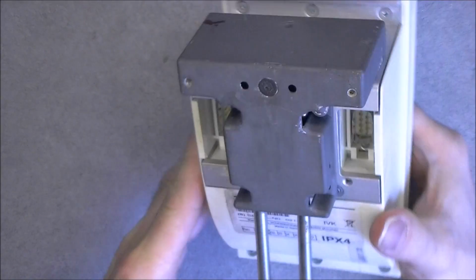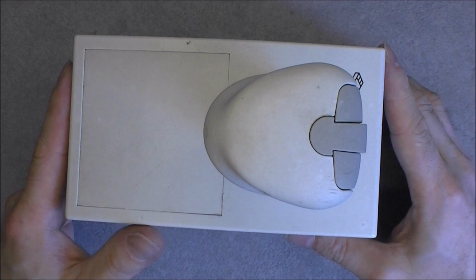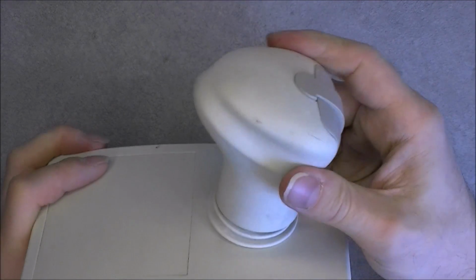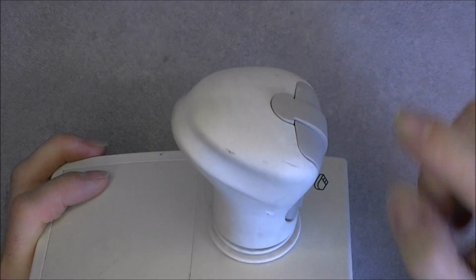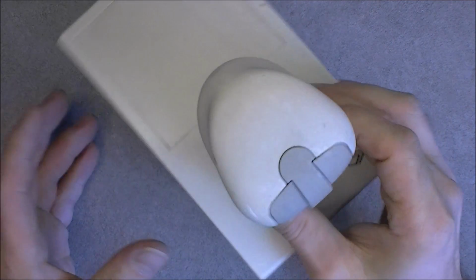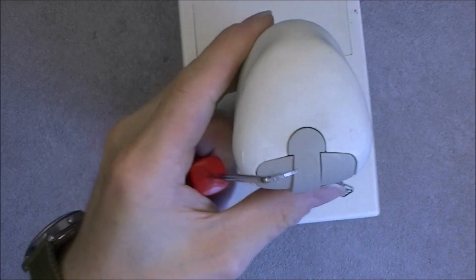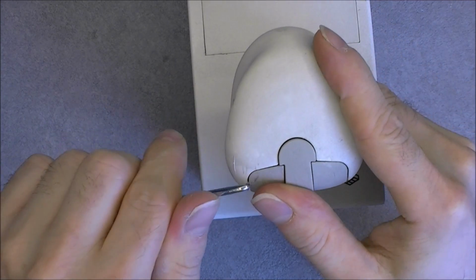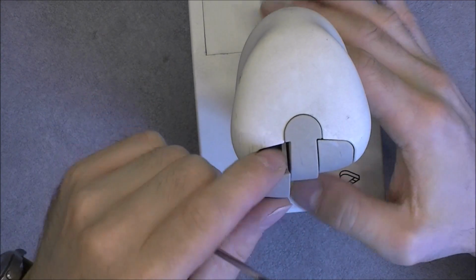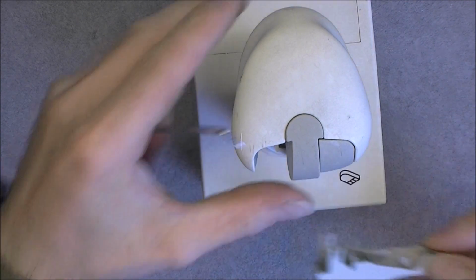So, first thing, I will not remove it immediately because it will be convenient to put it on the bench. I have a feeling this thing will be in the way when I want to remove the joystick part. So I need to find out how to take this apart. It is the first thing to do. So let's try to pry out. There is no screw, nothing I can see. I have a feeling, yeah, it was easier than expected. It just pops right out like this, as you can see.